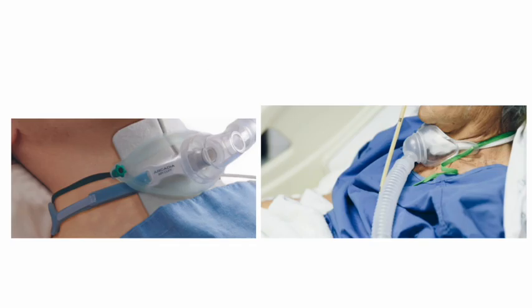So when you're on your ICU rotation, you'll frequently hear the respiratory therapists or the ICU nurses refer to a patient being on a trach mask or a trach collar. And this is a mask that is placed over the tracheostomy tube. And the purpose of a trach mask or trach collar is to provide humidified air, which is blown over the tracheostomy. So we rely on the oropharynx to humidify the air that we breathe, and a patient with a tracheostomy bypasses the oropharynx. So the purpose of the trach collar or trach mask is to humidify the airway. So a patient that's on a trach mask or trach collar is not attached to a mechanical ventilator. So if you hear the nurses refer to a patient being on a trach mask, that means that they're breathing spontaneously on their own, and the mask is just there for humidification of the airway or for supplemental oxygen.